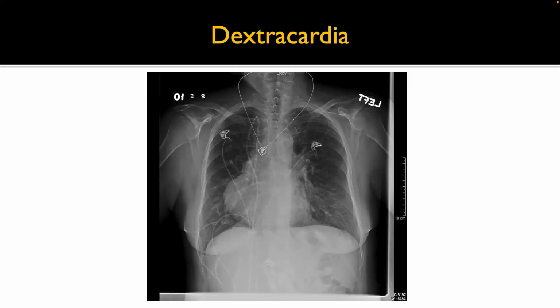Biggest thing, like everything else, make sure that you just keep looking at X-rays over and over again. Go through a systematic process. I teach, and I love using, the ABC method. Make sure that your X-ray is good with regards to your RIP process, and then enjoy.